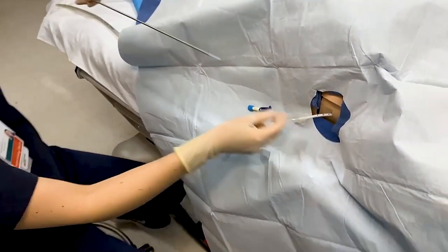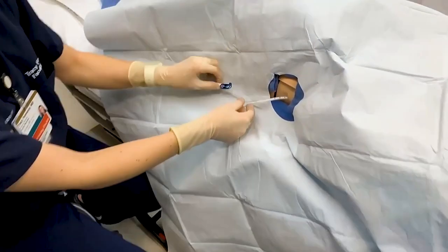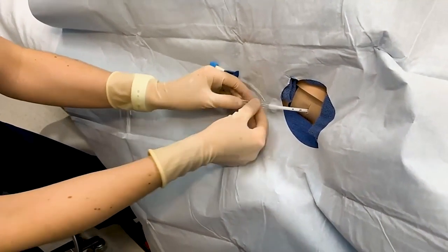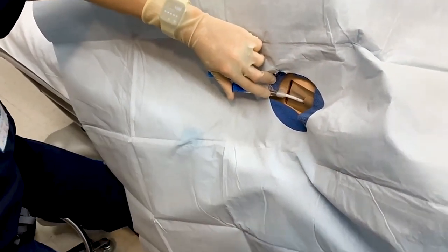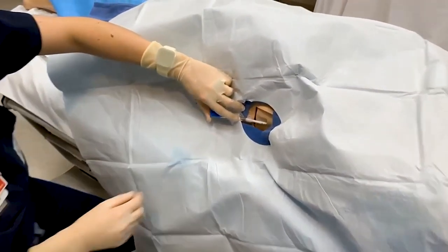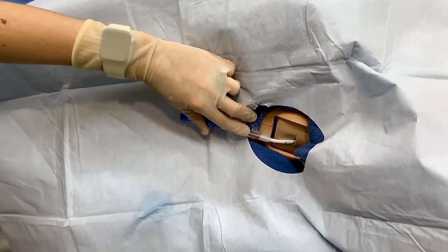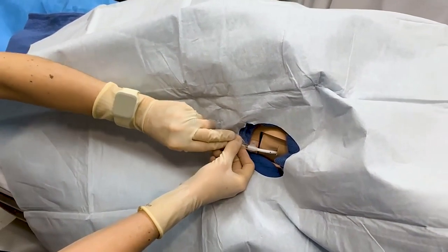Out comes the wire and the Trocar, and now you have your chest tube in place. The kit comes with a blue cap to cap off your chest tube. Alternatively, just like typical surgical chest tubes, you can hook that up to your Plurivac. Suture through the eyelets to stabilize the tube in place and put your typical sterile dressing overlying this. Get a post-procedure x-ray to confirm tube placement.